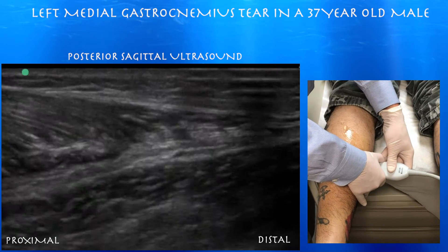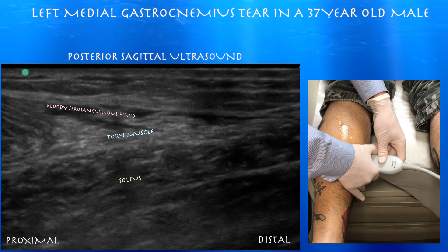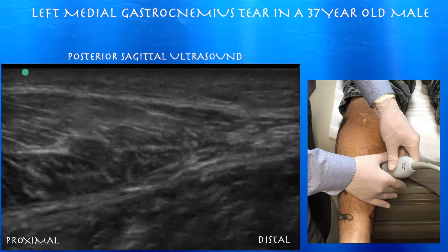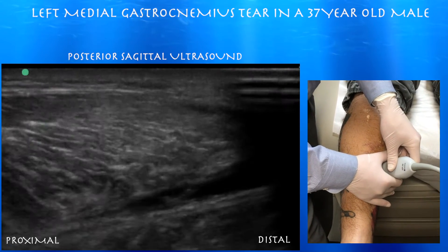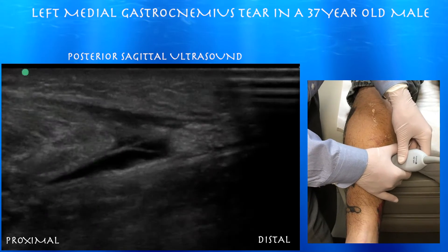Here you can see some irregularity. That distal medial gastrocnemius muscle has a little irregularity, and the plantaris tendon as well, underneath it. But the main finding is a torn distal medial gastrocnemius muscle — your typical location for that. You can see the muscle fibers themselves bunching up distally, consistent with the tear.